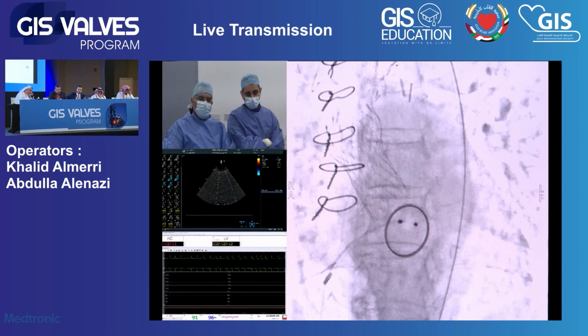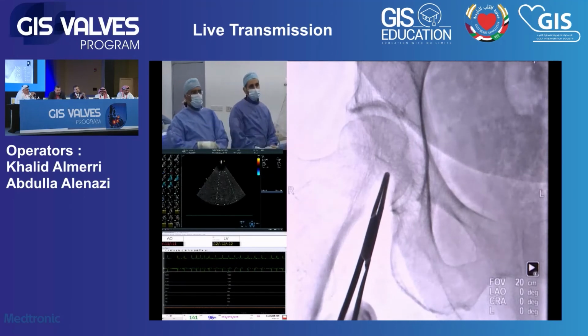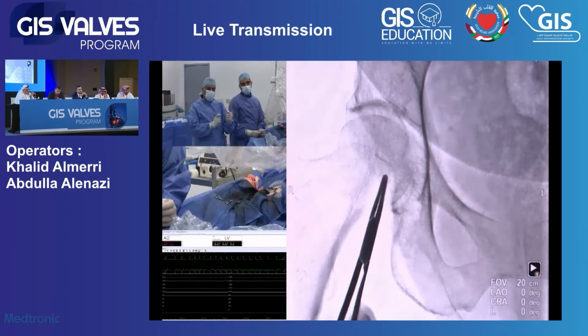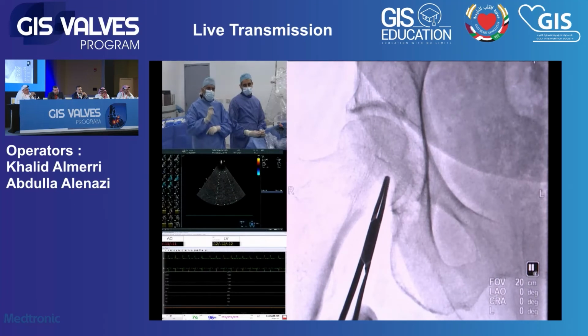Sure. Basically, when you start doing ultrasound, you should mark the head of the femur with fluoroscopy, and we can show here how we do it, because you tend to stick higher with ultrasound. So usually we localize where the head of the femur is, and then we go with the ultrasound and stick wherever we think the common femoral is. Once the wire is inside, we fluoro again to make sure the needle and the wire are in the right spot. Because ultrasound is a great tool, it's excellent, but you tend to stick higher. So if the stick is higher than what we think is right, we just take the needle out. This is how we do it.